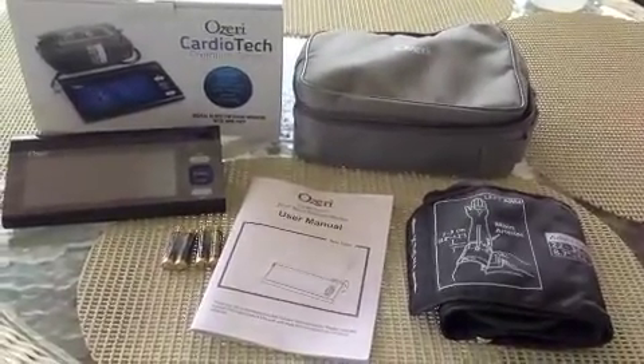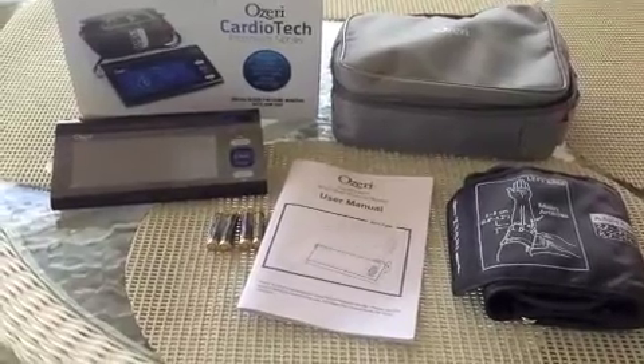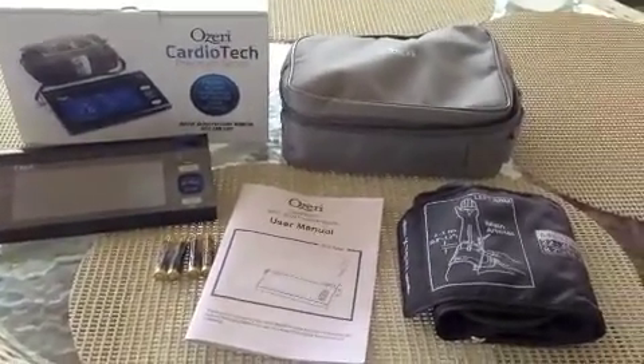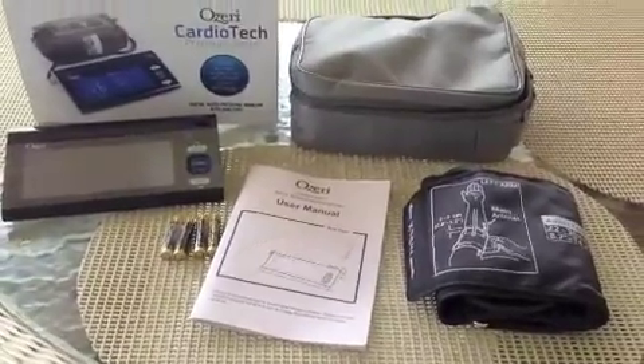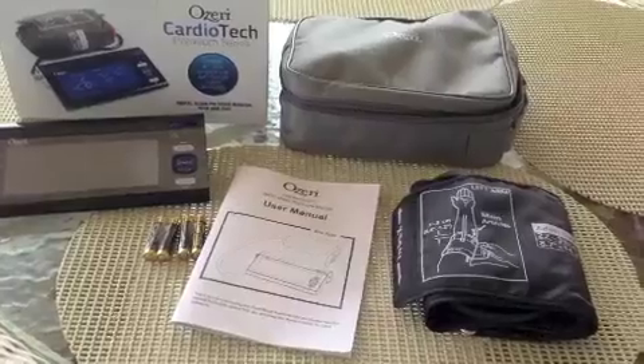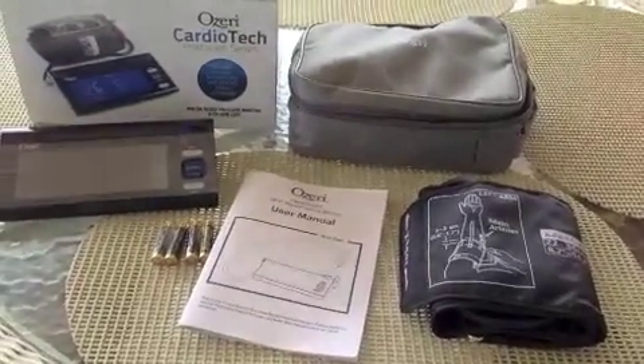Hi, this is Mary from Plum Crazy About Coupons and we're here with the Ozeri Cardiotech Premium Series Digital Blood Pressure Monitor with Arm Cuff. We're going to be trying it out today. I have high blood pressure and my husband has been telling me for a while that I need to take my blood pressure more often, so now we'll be able to.